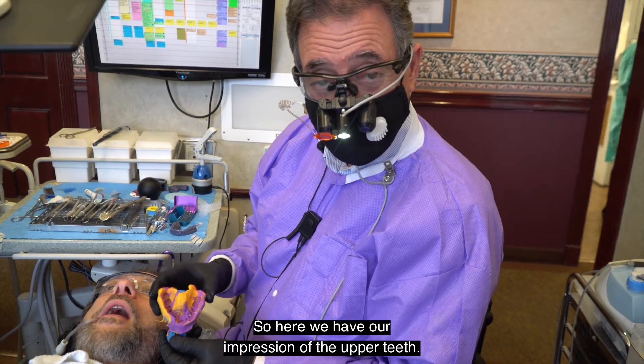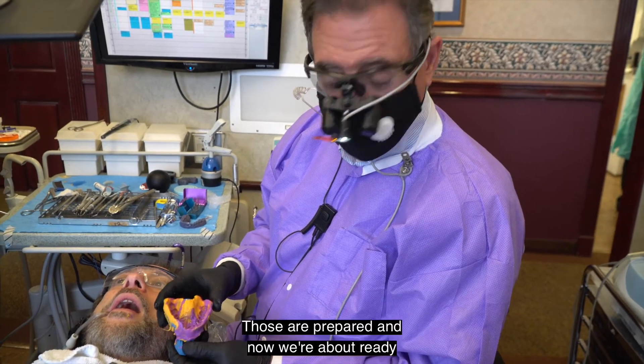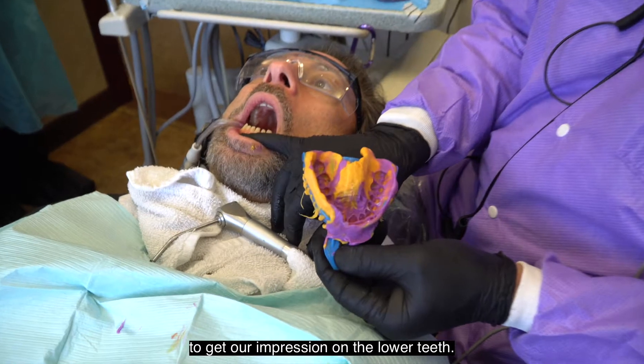Here we have our impression of the upper teeth — the veneers are prepared — and now we're about ready to get our impression on the lower teeth.